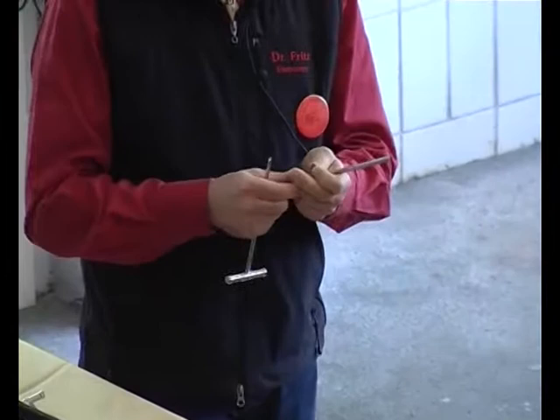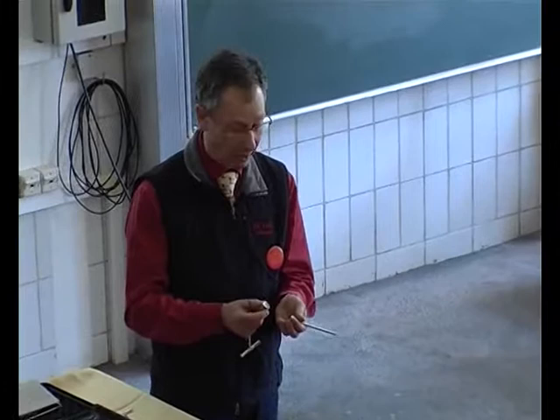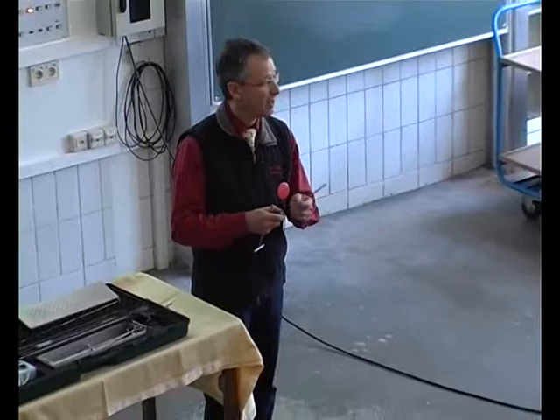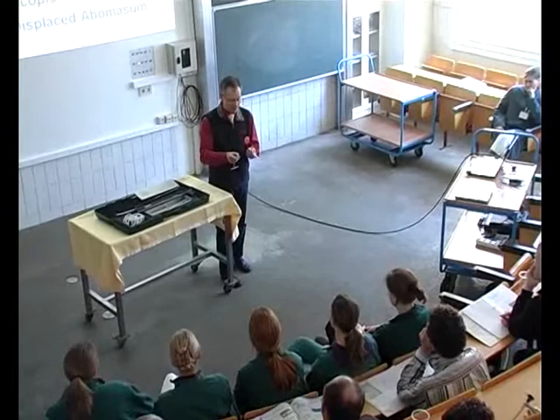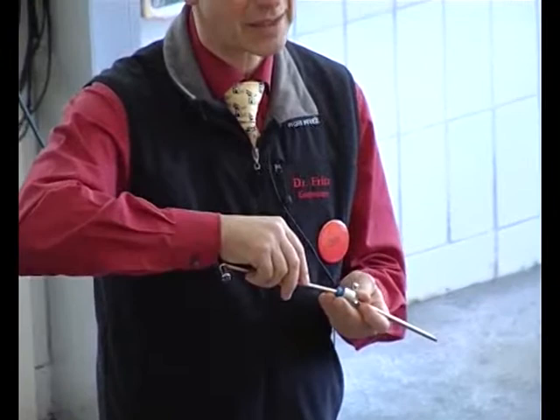And the good thing about it, it has no other mechanical parts in it except this magnetic flap valve, and it's very easy to clean. Sometimes it's good for us as a company because some people lose this, but unfortunately, a little penny out of your wallet will also help in emergency cases, so it's very easy to replace. The little silicone cover is somehow semi-disposable. You can autoclave it, but by pushing the sharp end of this trocar through it, you get little cuts, and so you will lose air. So sometimes you just remove these little covers.